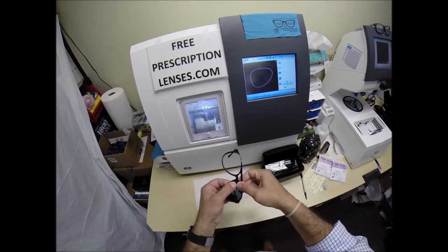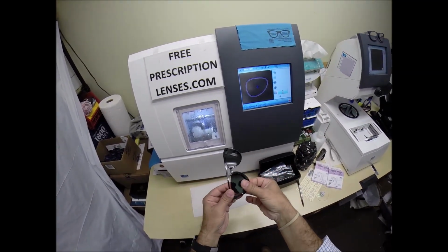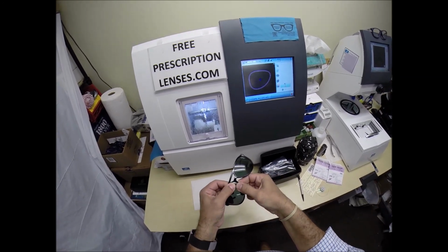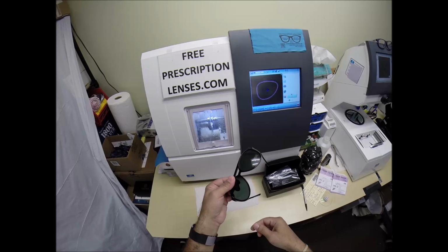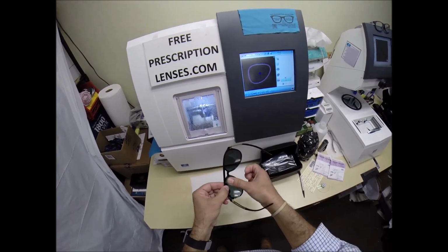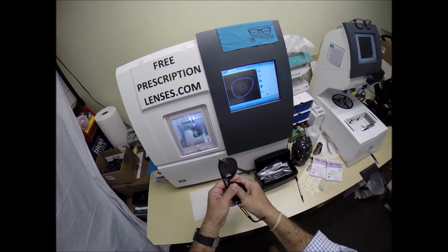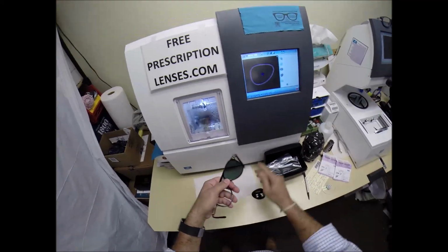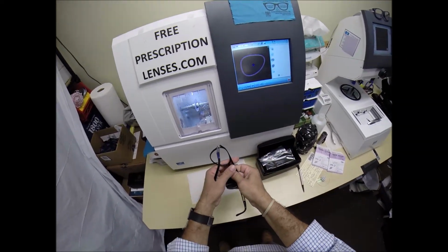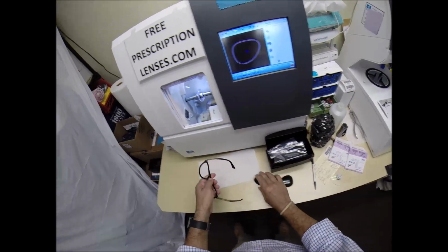With your thumbs, just press down at the nose, same thing. I rotate it to have the side I'm working on closest to me. Tuck it in at the outside corner first. With your thumbs, press down at the nose. Now in order to take the lenses out, just the opposite. I rotate it down, I put my thumb at the nose, I grip the lens on both sides, put my other thumb on top, and then just press down. Same thing, I rotate it, put my thumb at the nose, grip the lens so it doesn't fall on the floor, put my other thumb on top, press down, out they come.